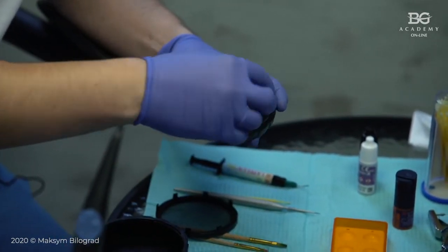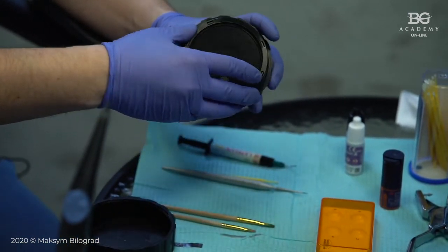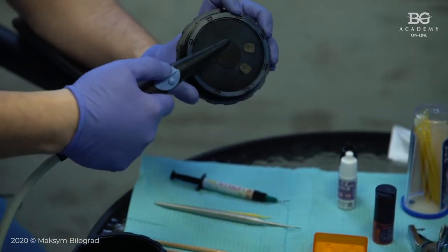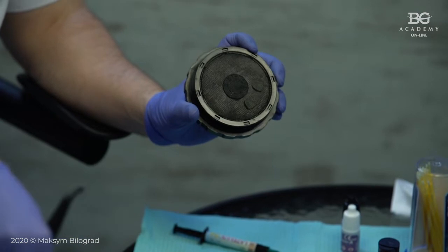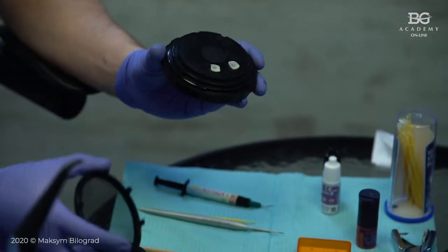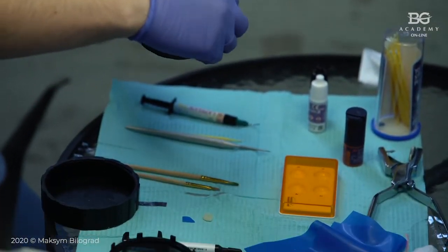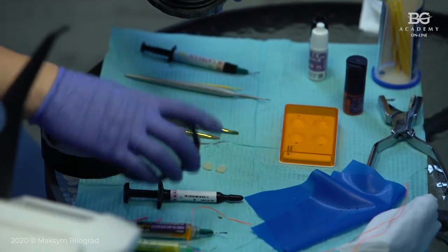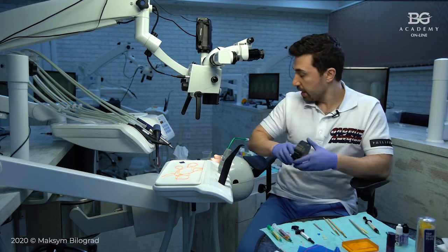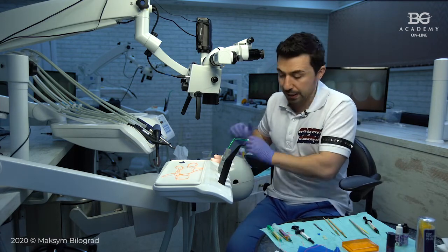multiple veneers, see, you can etch them, then you can cover it with a special cover, then you can rinse, you can dry, everything is here, okay. So it's easy to use. It is an ergonomic tool. So you can prepare the surface of ceramic for bonding in advance by yourself, or by the dental lab, or by your assistant. In scenario number 3, you will do it like we are doing it here.